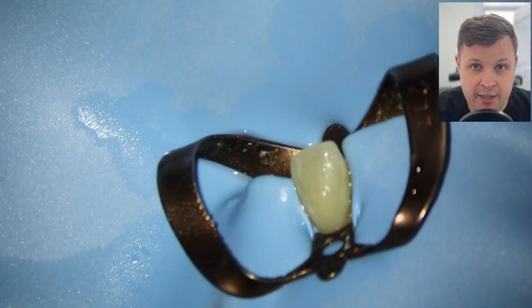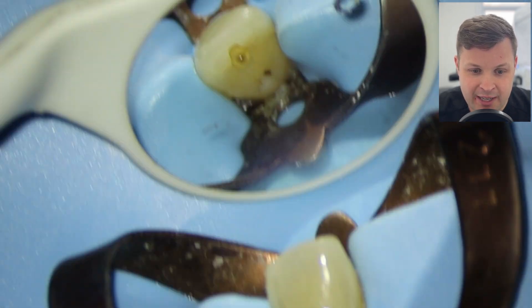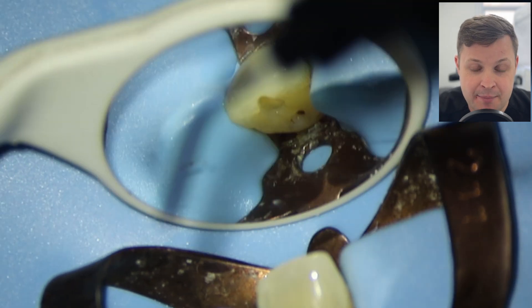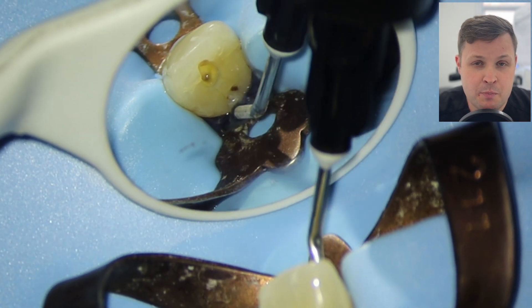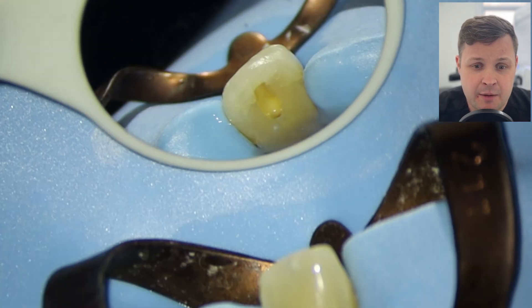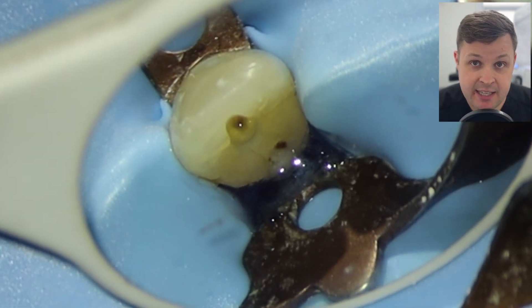What I like to do is use an ultrasonic tip to use some of the energy from that just to break through into the pulp chamber. After having a look around, the patient had noticed a little bit of leakage from the dam especially when we started to use the hypochlorite, so I'm going to use this light-cure liquid dam — it's much better than a corking agent, less messy, it sets, and you've got more control over it.